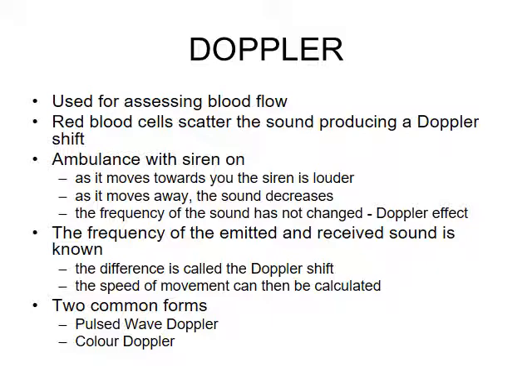Now, we know the siren on the ambulance isn't changing. The siren is exactly the same. It's coming out at exactly the same frequency or exactly the same loudness. But what's happening is, because we're standing still but the ambulance is moving, we're perceiving a change in the frequency. And that perceived change in frequency is referred to as the Doppler effect.